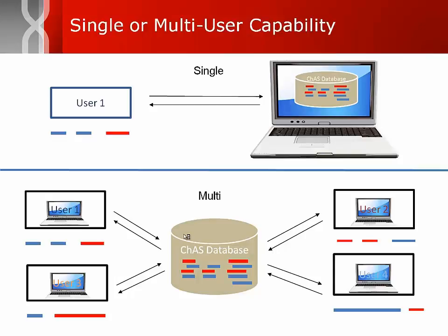What having these two different types of setups enables you to do is, in the manual, you will see a description of offline mode, or sometimes we call it airplane mode. What that means is, here I am, user 1, at my organization, and most of the time I'm in this central ChAS database when I'm querying and using the resources for that database.